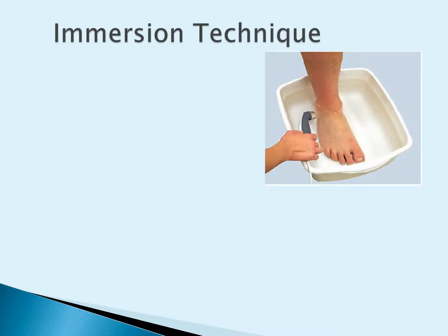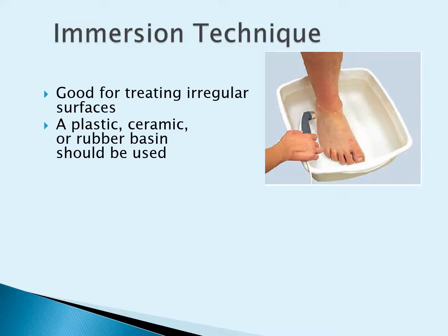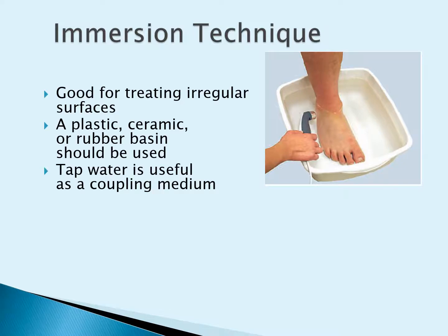Immersion techniques, or underwater techniques: we're going to use water as the actual treatment medium. We can use a plastic bucket, a basin, or even a tub if we have those. Tap water is useful as a coupling medium. Again, water transmits sound better than air, so water will still allow the sound to transmit to the body.